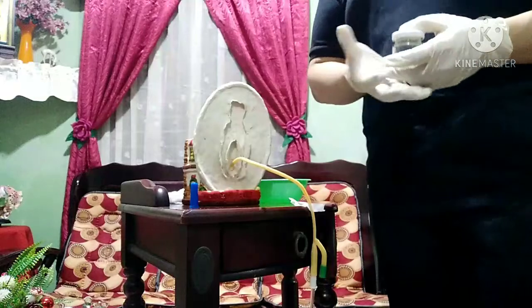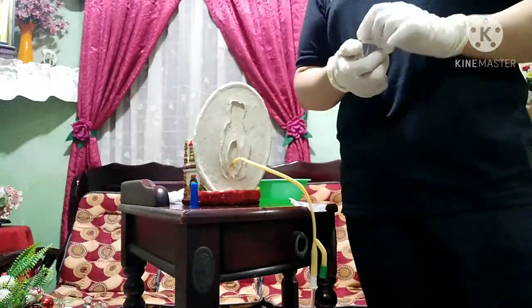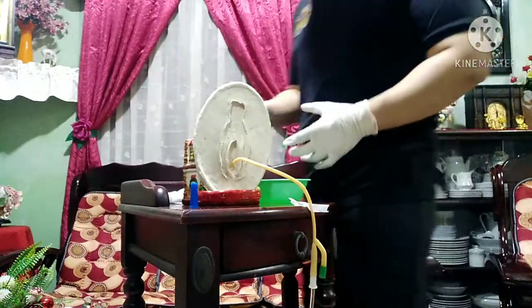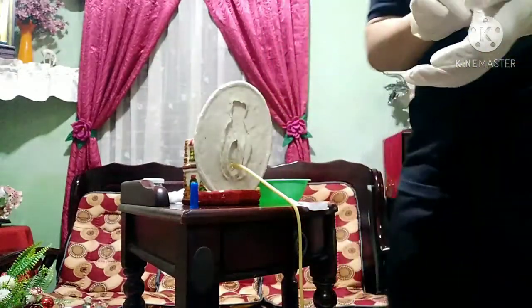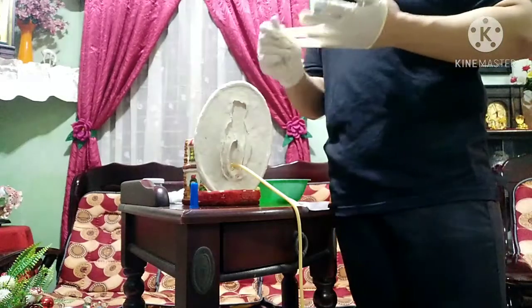So step 27, cleans used articles and discards disposable articles according to hospital policy po. So, yung mga ginamit po natin, like yung mga cotton balls, ito pong sterile gloves, i-discard na po natin. Tatapon na po natin siya. So, tanggalin na po natin. Ayan.